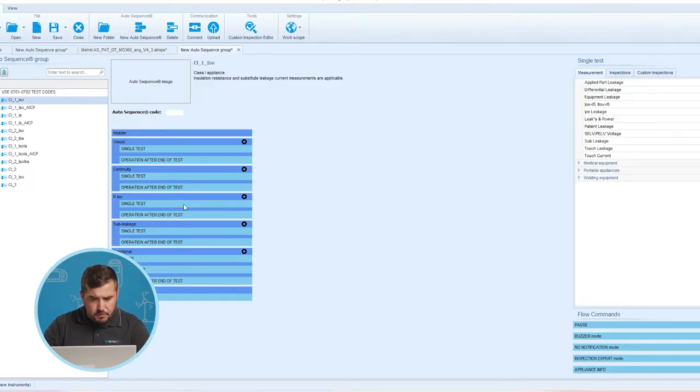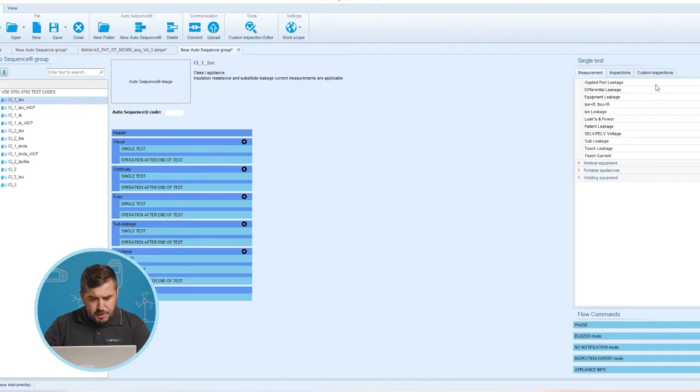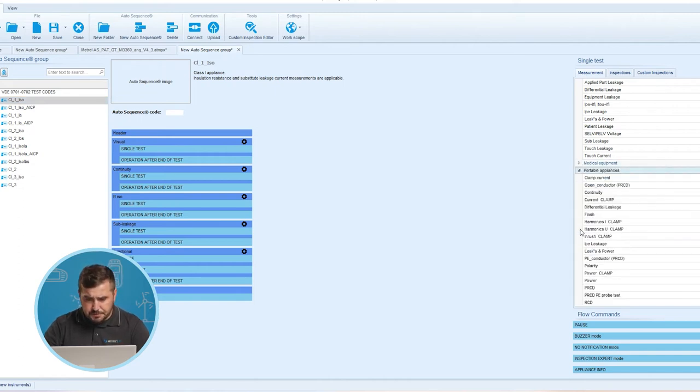Now is also the right time to say a few words about elements located on the main window. On the right side we can find single tests that are the same as those supported on the MI3360 single tests menu. Limits and parameters of the measurements can be set, as well as results and subresults. The measurement menu is divided into different subgroups, each containing specific and generic measurements for a certain application. When creating custom auto sequences, care must be taken to select the appropriate single test according to the test terminal through which the test will be performed on the instrument. This information can be found in the user manual of the test instrument.